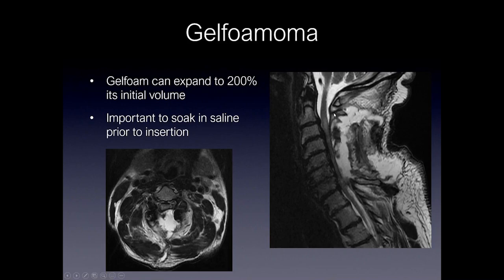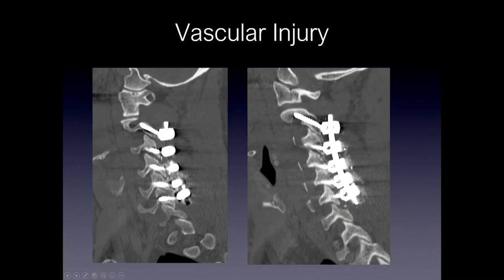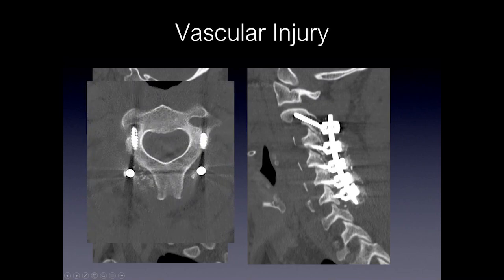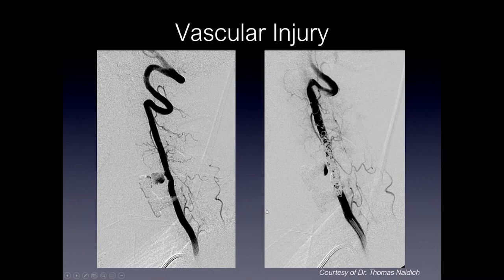Vascular injury is an important thing to identify. In this patient, the lateral mass screws look good on one side, but on the contralateral side the screw is approaching the transverse foramen where the vertebral artery sits. On the axial, you can clearly see the screw entering the transverse foramen — if you see this, certainly mention it and you can request a CT angiogram for evaluation of the vertebral artery. In another case, an ACDF resulted in a pseudoaneurysm off of the vertebral artery, which was ultimately treated with coiling to close off the aneurysm.